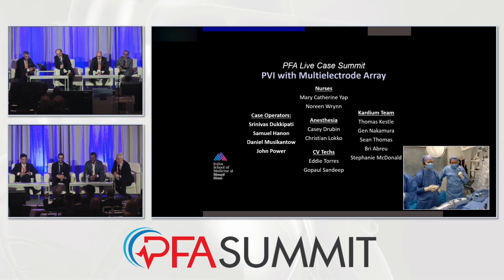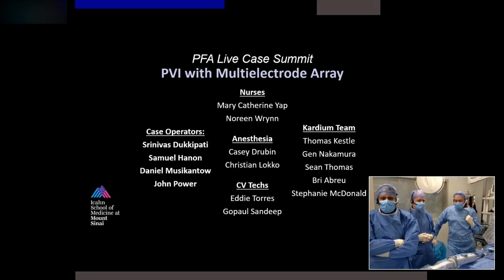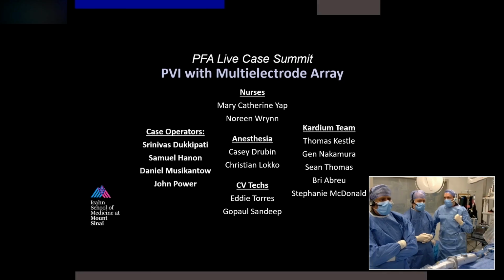All right. So welcome to Mount Sinai, everyone. We have a case here, PFA with PVI with the multi-electrode array. My colleagues here are Sam Hanon and Dan Musikantow, and the fellow is John Power. He's sitting outside, and he's going to start briefly with the presentation.